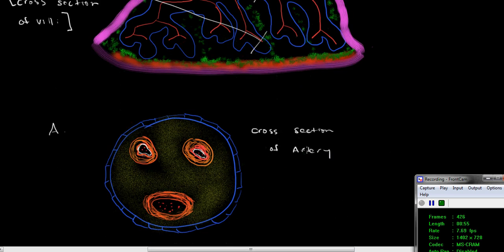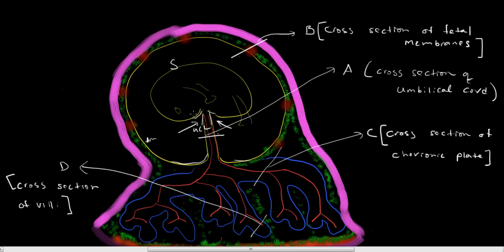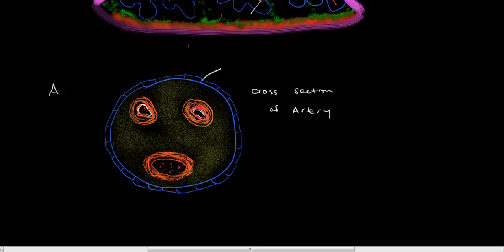So let's consider what a pathologist looks at when she's looking at a cross-section of the umbilical cord. Because of that continuity we spoke about between the umbilical cord, the skin and the amnion, it's not surprising that the outer lining of the umbilical cord would be what? You guessed it, amniocytes. And then, running within the matter of the cord are the fetal vessels that are delivering fetal blood to the distal villi for gas exchange with the maternal circulation.